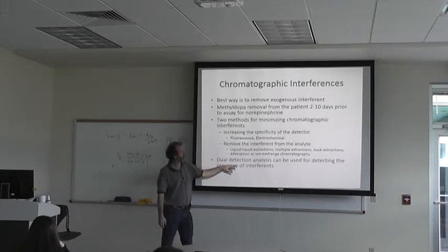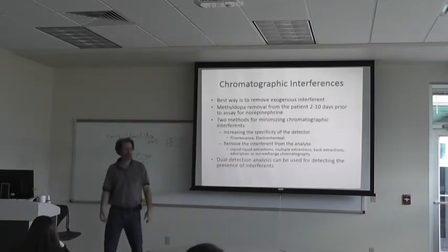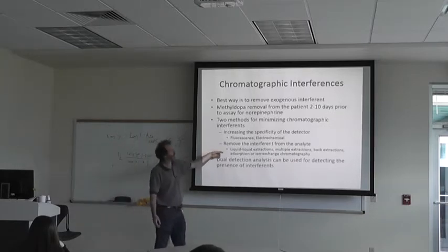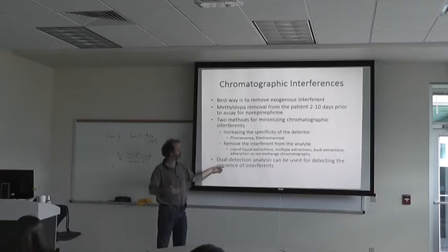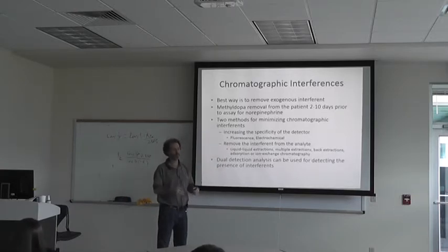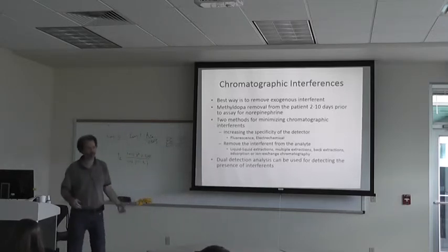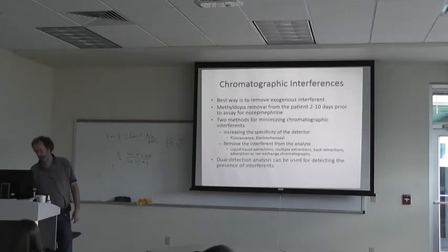A dual detector analysis can be used for detecting the presence of interference. You can use absorbance and fluorescence, or absorbance and electrochemical — two different wavelengths — because different compounds may have different absorbance spectra that help you differentiate between the interferent and the analyte you're interested in.